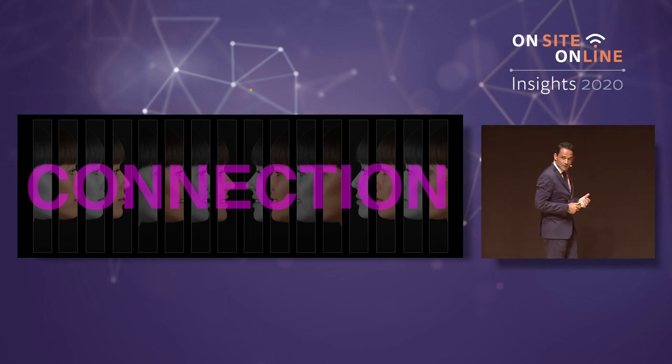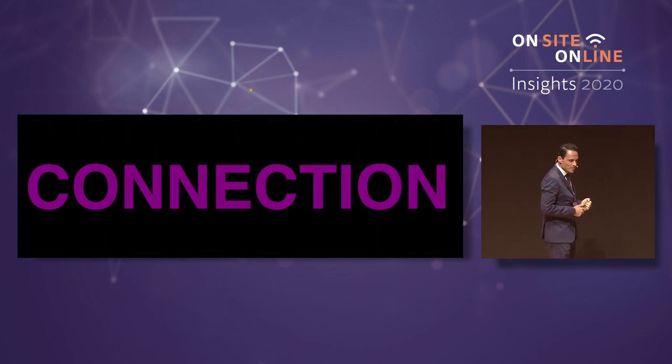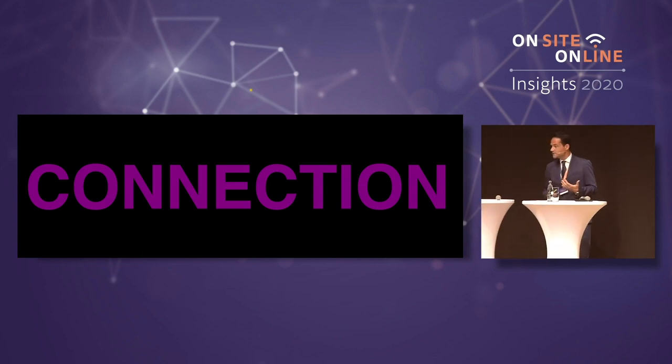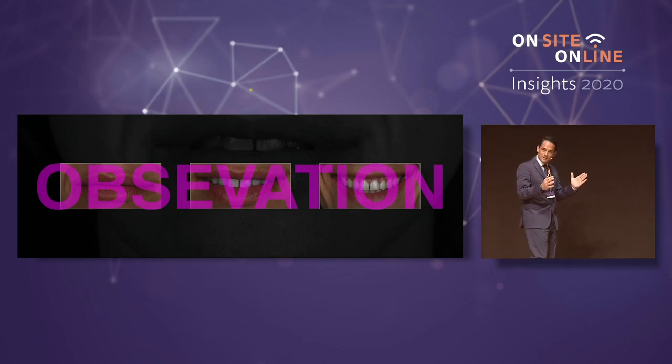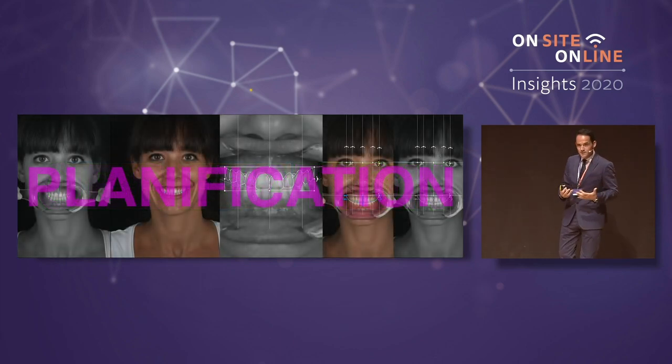What is the problem we have in the dental laboratories? Is that we don't see patients. We have no patients in the lab. So imagine the possibility to create a virtual patient, a digital patient, and this patient is going to be with us, helping us to take correct decisions, helping us to choose the correct shape, the correct dental composition, helping us to make the correct planification.